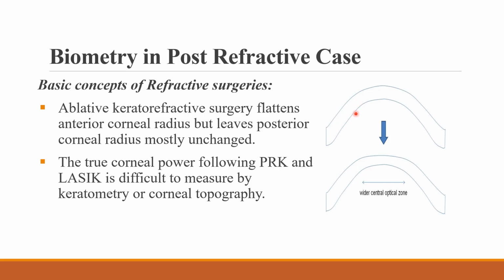You can see posterior radius of the cornea unchanged, but the anterior cornea here flattens. The true corneal power following photorefractive keratectomy and LASIK, laser in situ keratomileusis, is difficult to measure by keratometry or corneal topography.